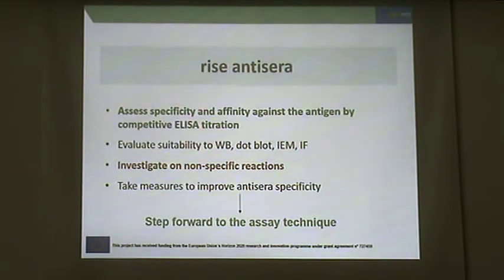Once we obtain the antisera, the first quality assessment consists in titration against the antigen, to prove the specificity and the affinity of the antibodies to the antigen.